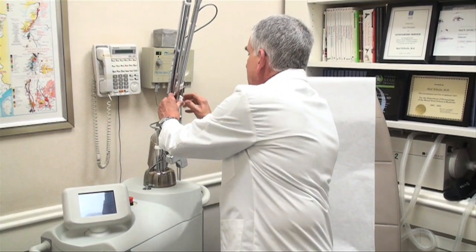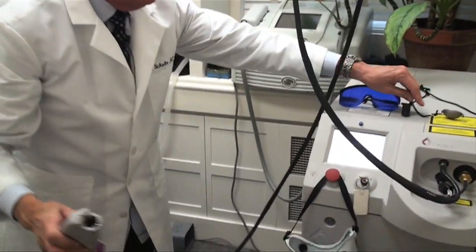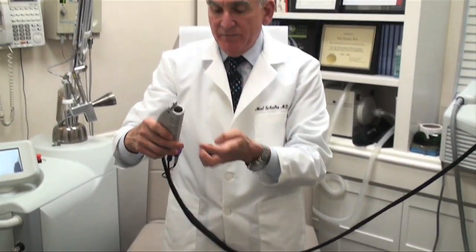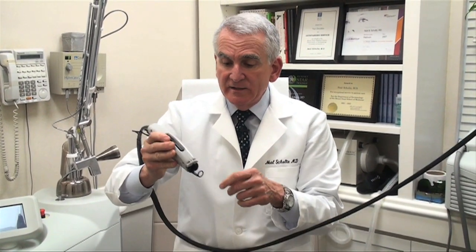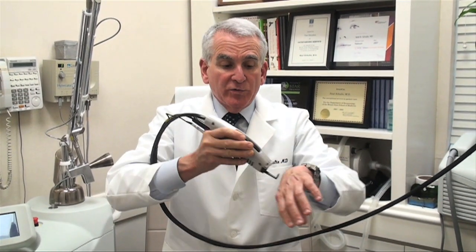The next laser I'd like to show you we use for removing broken capillaries and spider veins, especially from the face. If I apply this to the front of the laser wand, I can actually see through this little hole as the laser energy comes through. I can see the blood vessels snap away or just disappear from the laser treatments, and I go from place to place, usually on the face — we may even do it on the legs.